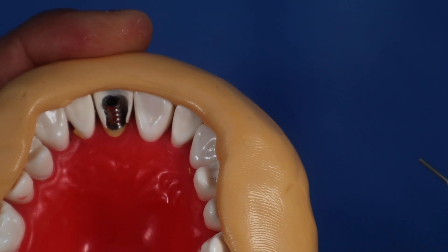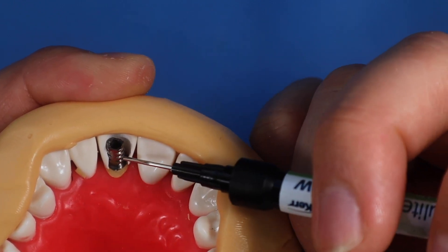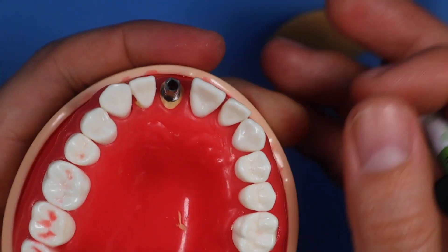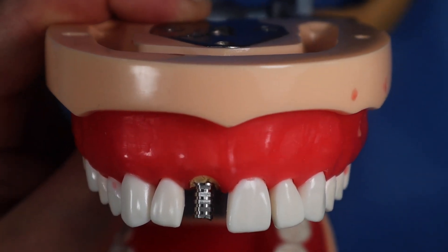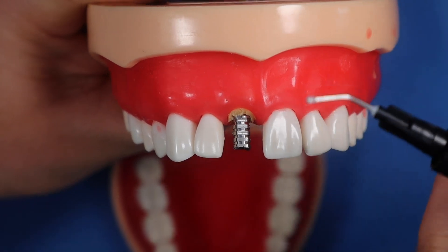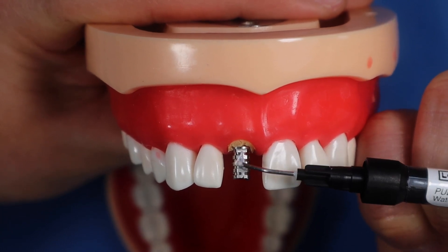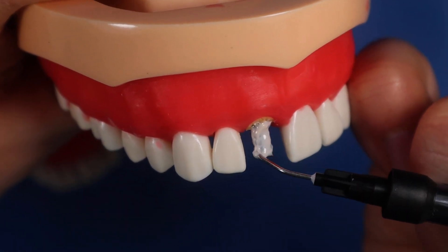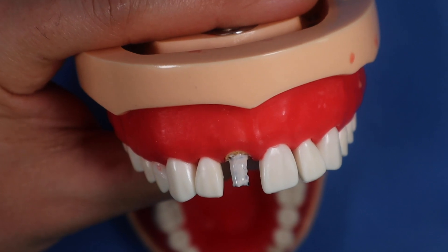Now that the tooth shell and cylinder are in position, you can go ahead and inject composite in there to attach those two. One thing you can do above and beyond: before placing the tooth shell, apply some opaquer to the titanium cylinder. A little bit goes a long way — too much gives a whiteout appearance. Put a little bit of opaquer on there, and I think that's going to be good enough for a nice temporary. Go ahead and cure this right now.